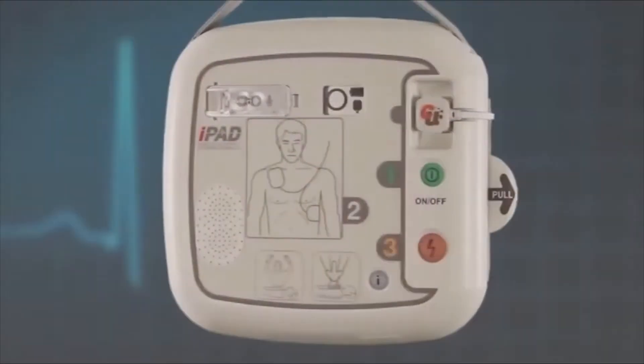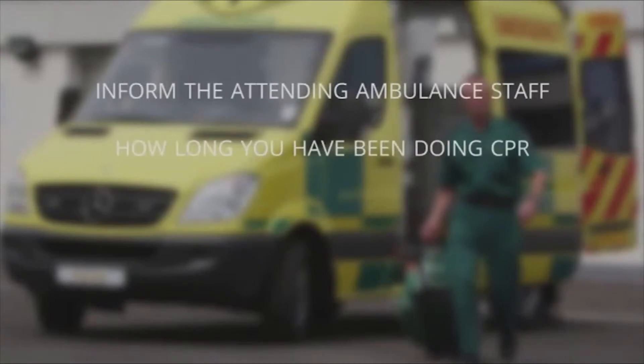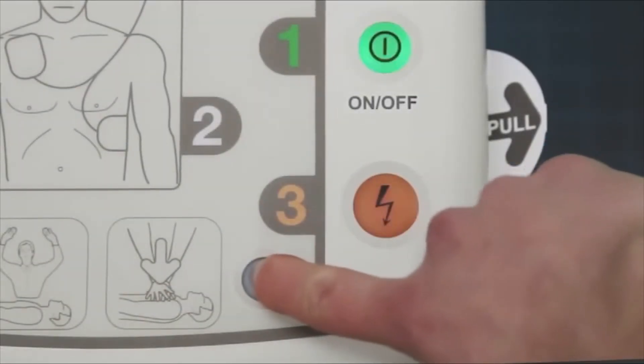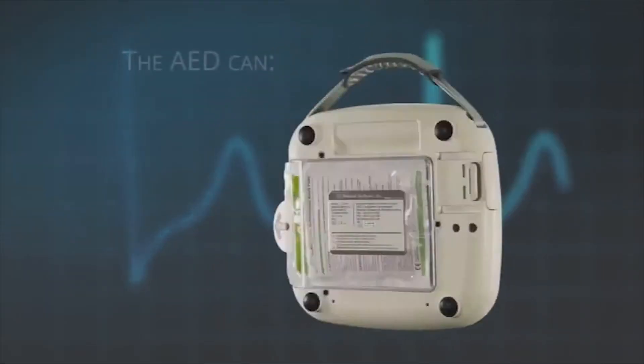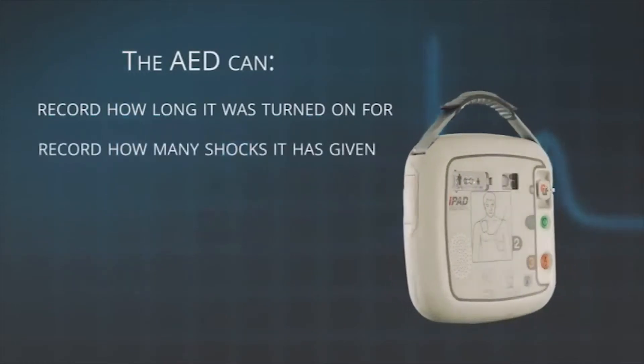If you have to use your AED, it is always important to inform the attending ambulance staff of how long you have been doing CPR and how many shocks you have given. This is easily done with the iPad SP1 by turning the AED off and then holding down the blue I button for more than one second. The AED will immediately tell you how long it was turned on for and how many shocks it has given.